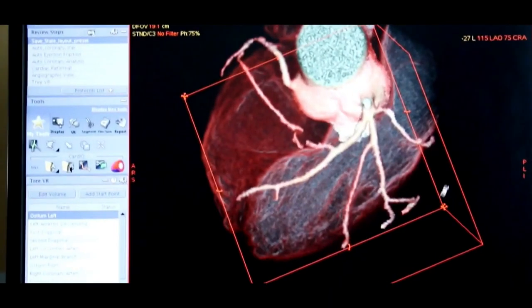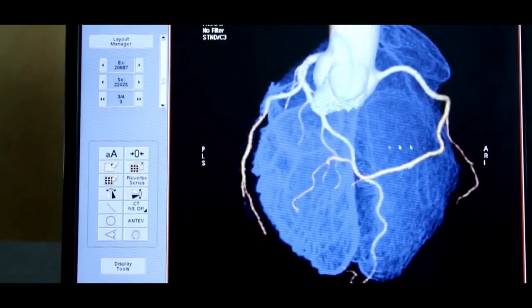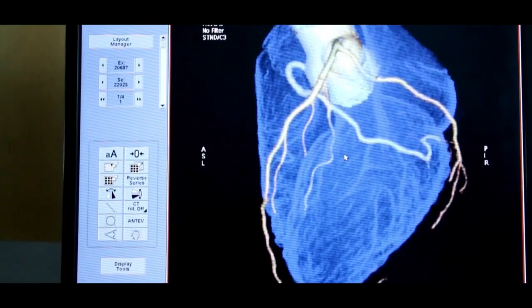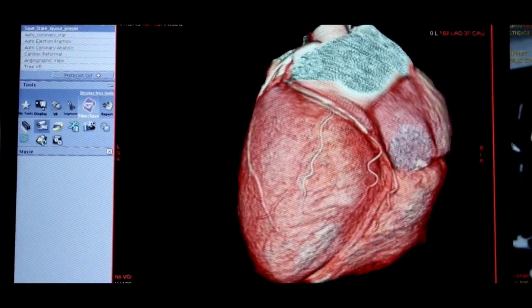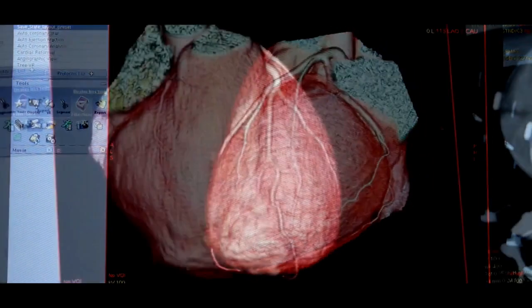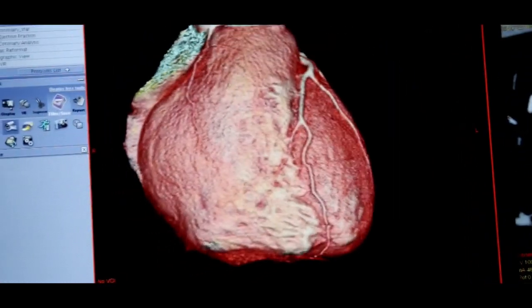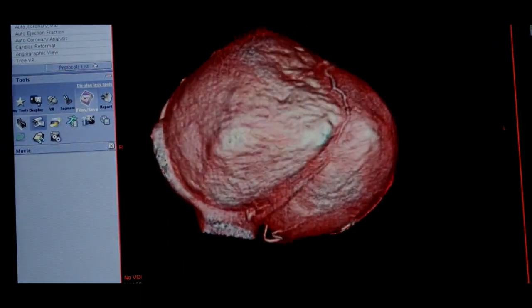Let's look into different kinds of CT scans. CT angiography. A doctor might order a CT angiography or angiogram if they want to assess a person's risk of heart disease. The scan can also help doctors detect damage to the blood vessels, such as aneurysms or blockages. Before the scan, a health professional injects dye into the blood vessels to help make the flow of blood through the body more visible. A CT technologist then takes images of the blood vessels.